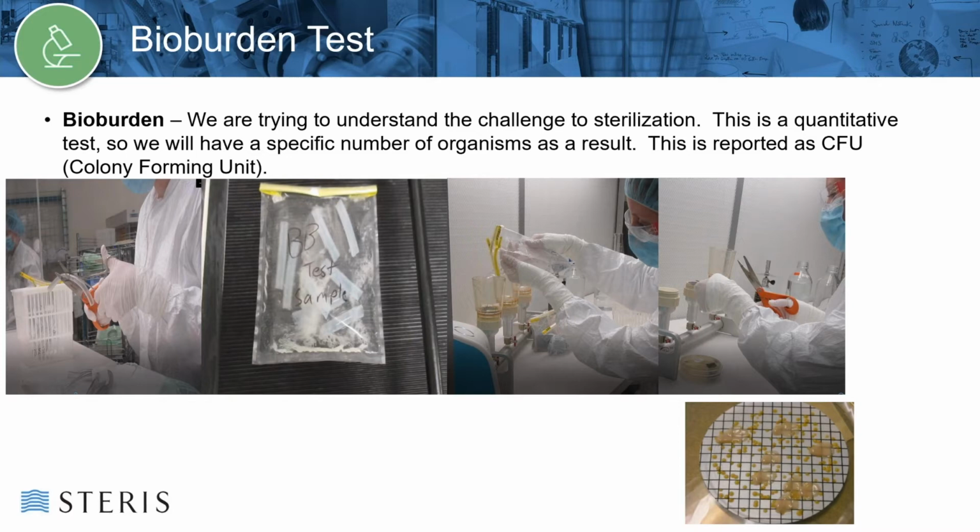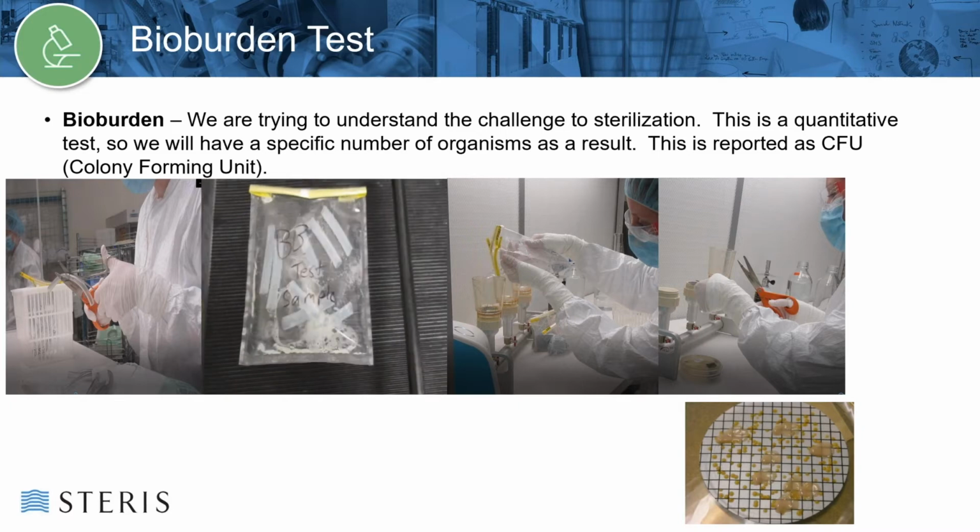A sterile pH buffered solution, usually containing a surfactant, is used to rinse the device and extract bacteria and fungi from the surfaces of the device. The method of extraction could include shaking, sonication, vortexing, stomaching, or a combination of methods.